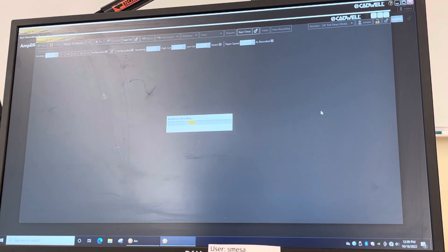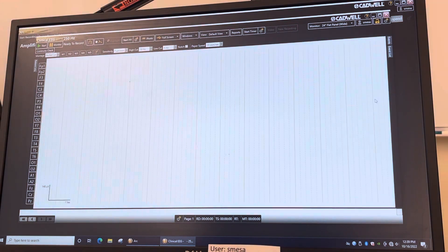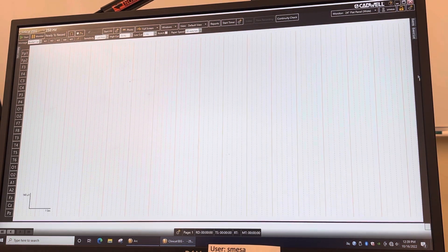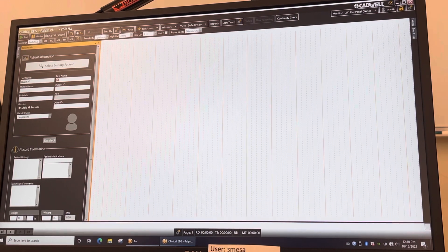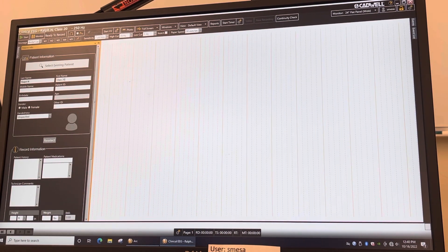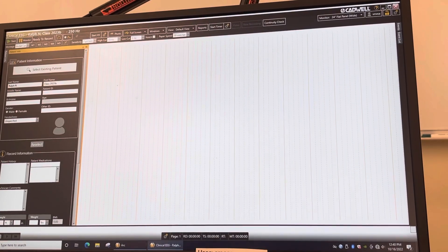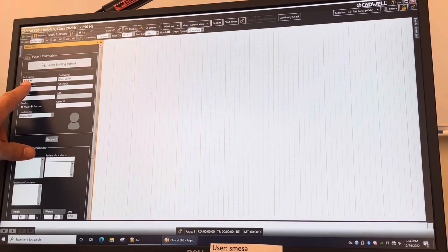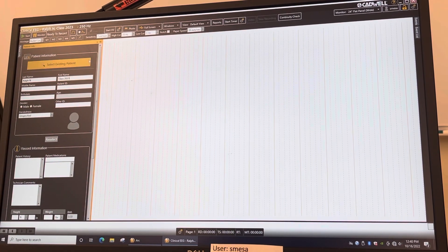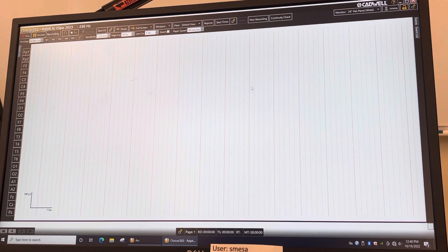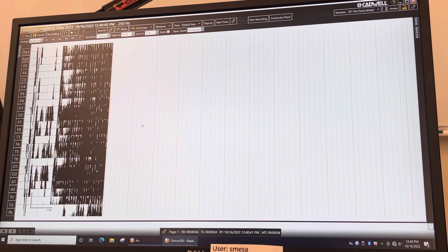To start an EEG you just hit 'Start Clinical EEG' and it'll open up into this screen. To start a recording, put a first and last name — in the last name field put your first name and last initial, and in the first name field put 'Class 2023'.